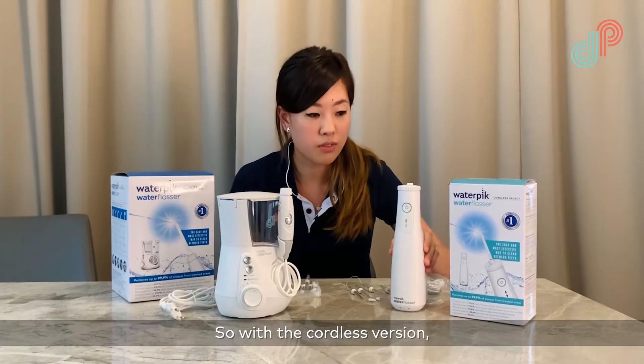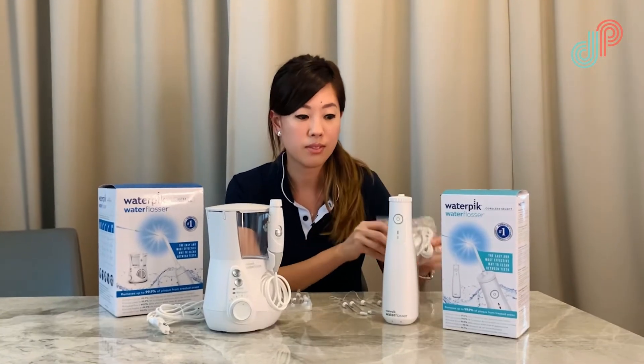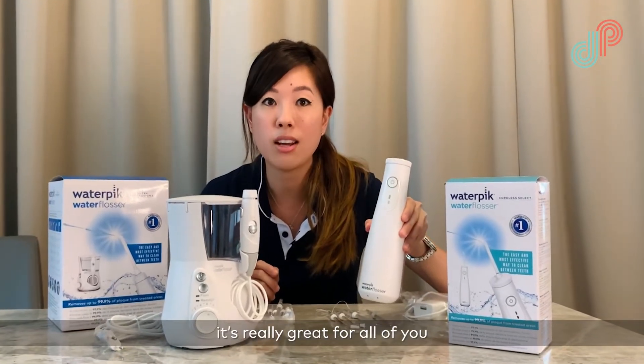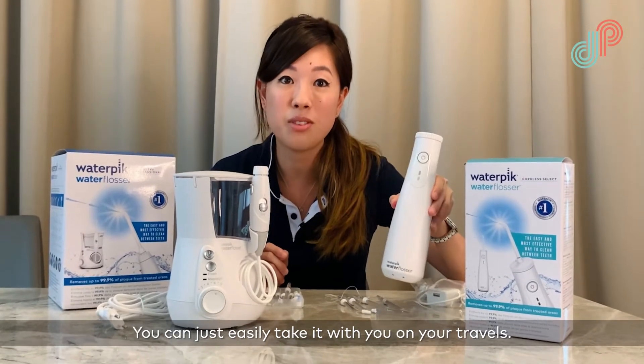With the cordless version they give you everything you need to easily charge it, and as you can see by its compact size it's really great for all of you who are going to be traveling — you can just easily take it with you on your travels.